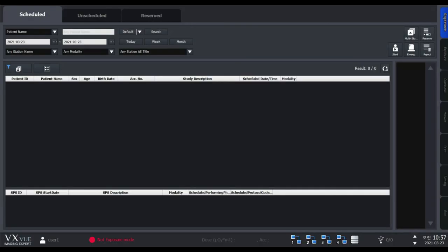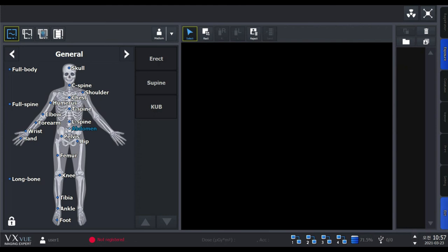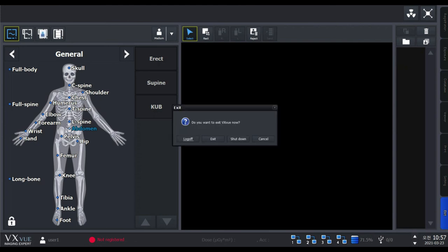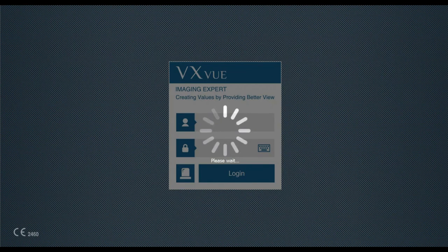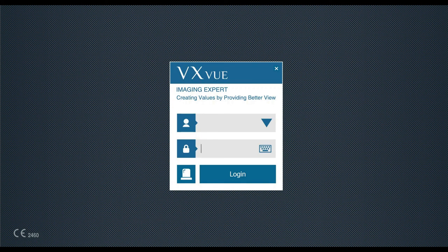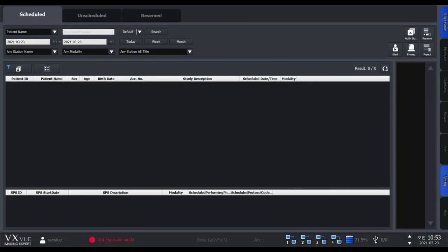If kiosk mode is activated, you have access only to VXVue from your PC. When you're logged in to a service or admin account, you can deactivate or activate the kiosk mode.